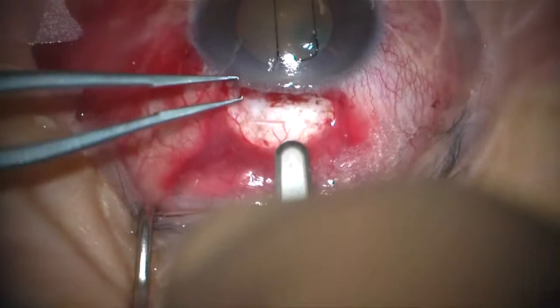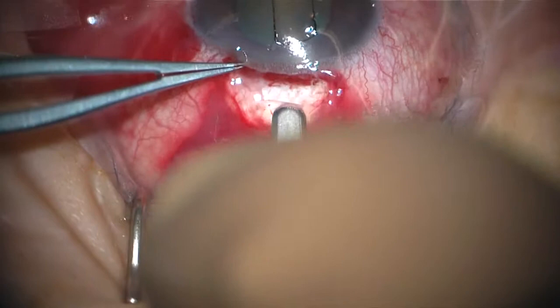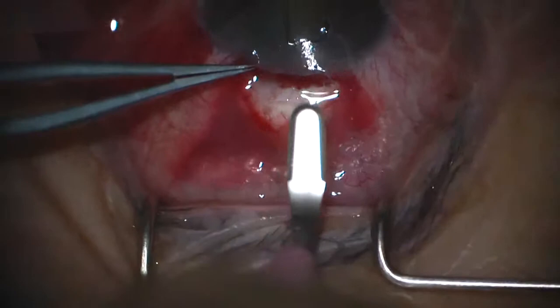So with my crescent knife, I'm going to get the tissue plane. And when I'm in the right place, I'm going to then move the heel backwards and then follow the contour of the sclera.